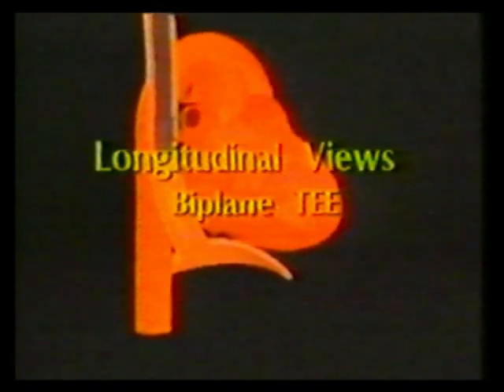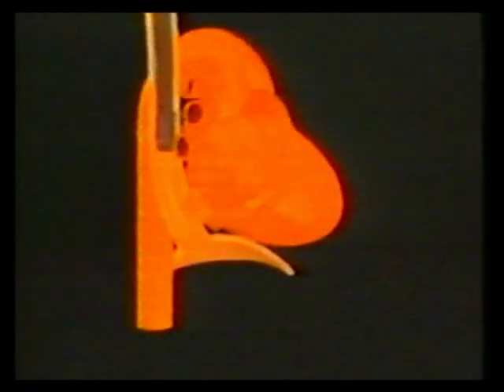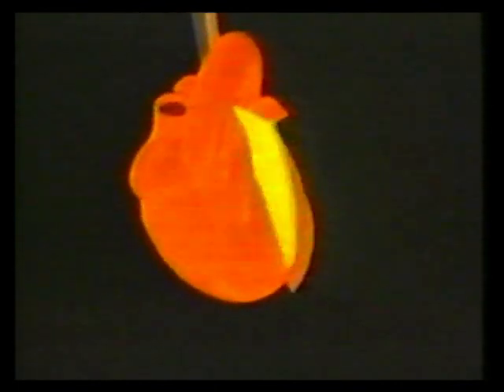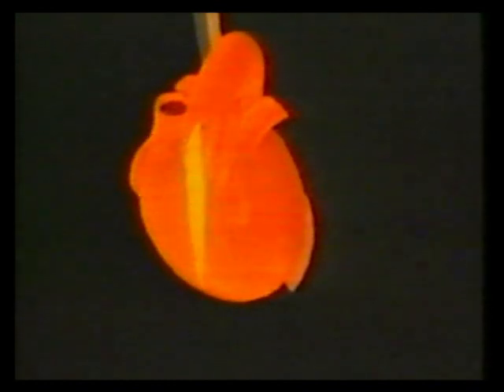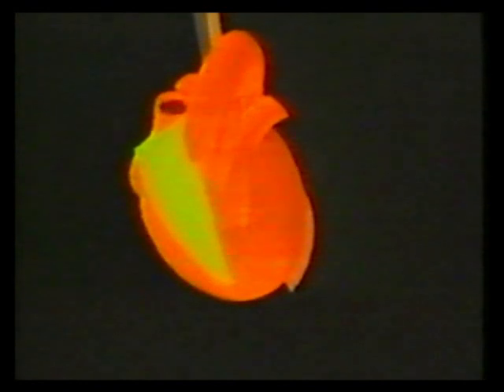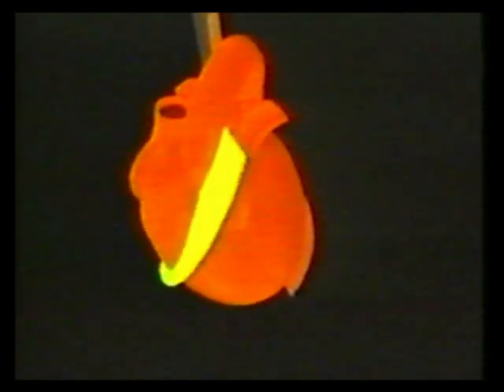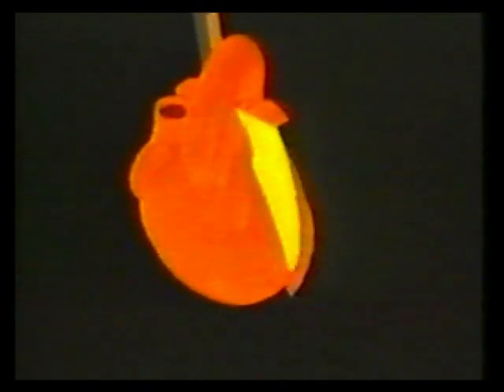The next animation is that of the longitudinal views from the mid-esophageal transducer position. Biplane scopes are utilized. These are best appreciated as sagittal views imaged from the left. There's the left atrial view, the right ventricular outflow view, aortic view, and superior vena cava view. From the aortic view, long axis and short axis projections are obtained by lateral and medial flexion of the transducer.